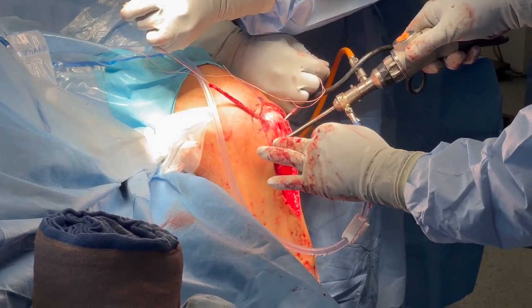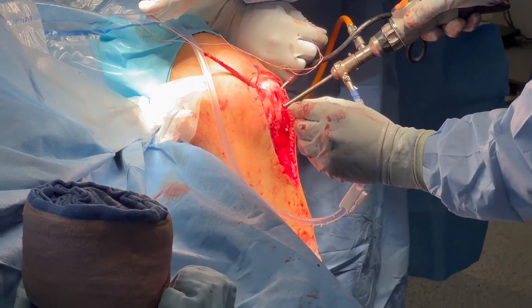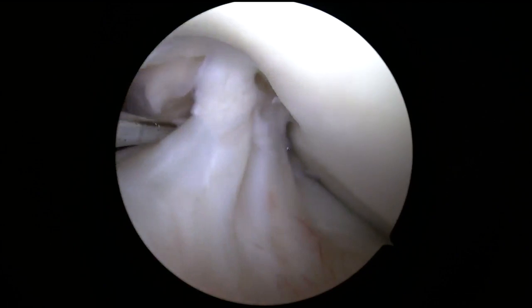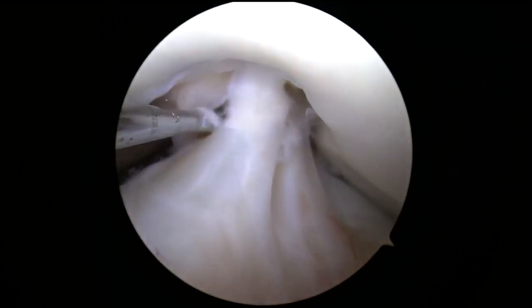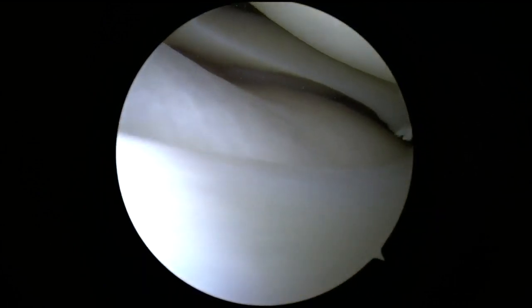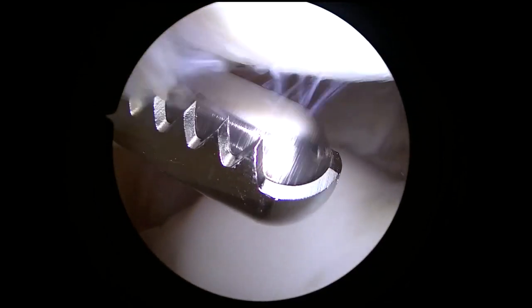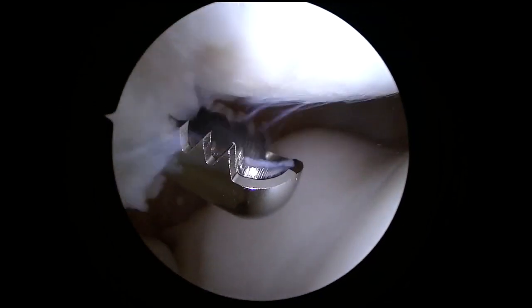When starting arthroscopy, care should be taken to ensure the portals do not amputate the grafts that have already been passed. For this patient, arthroscopy was performed to evaluate the internal structures of the knee. The ACL, PCL, and medial and lateral compartments of his knee were normal. The inferior pole of his patella had some grade 2 chondromalacia and a gentle patellar chondroplasty was performed.